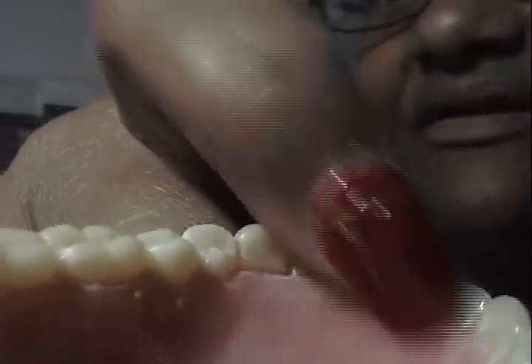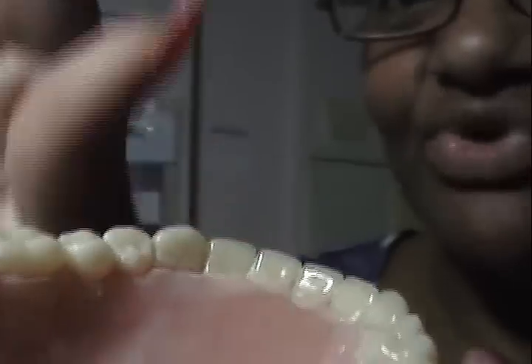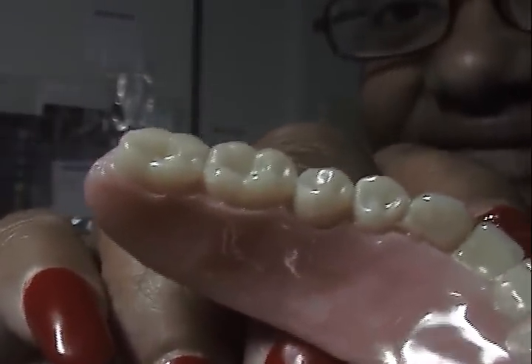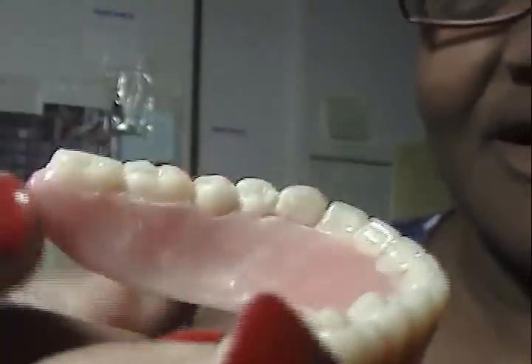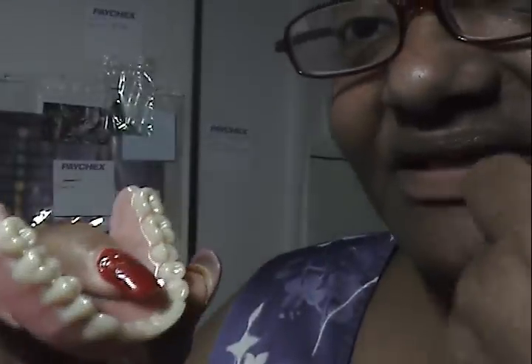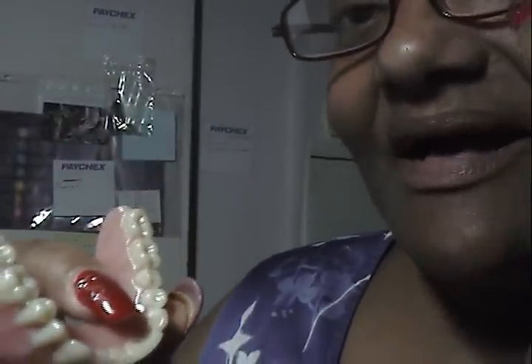So they're not smooth. See how these are nice and smooth right here? Like, you can't even feel that. Well, a little tiny bump, but it's smooth. These are ridges, like canyons. And then my tongue gets stuck there because I'm flicking my tongue. And then it gets stuck here because this is really a blunt end. So then on the inside of my mouth, it's rubbing.